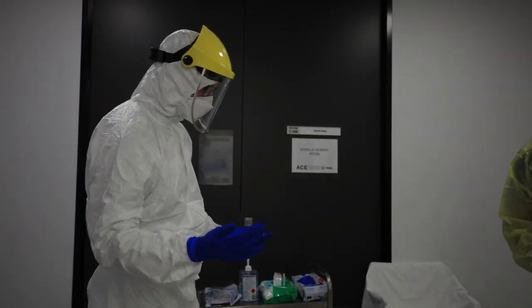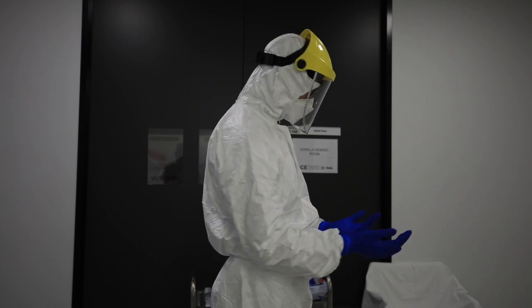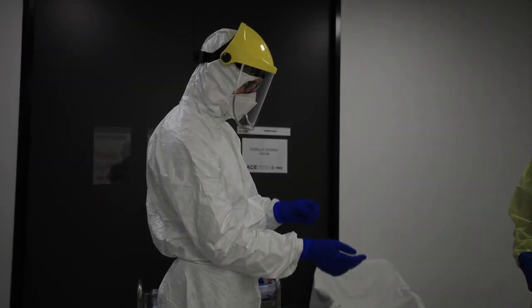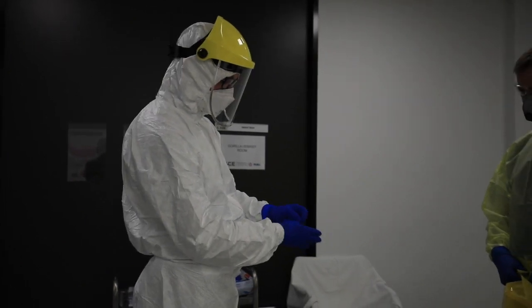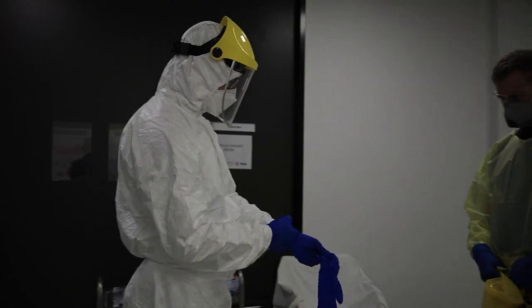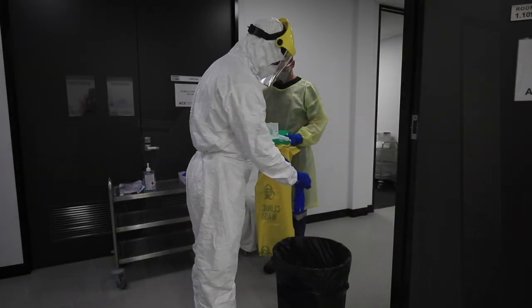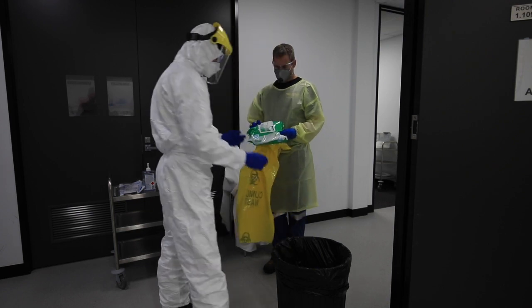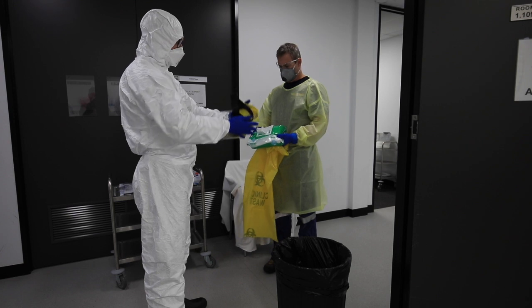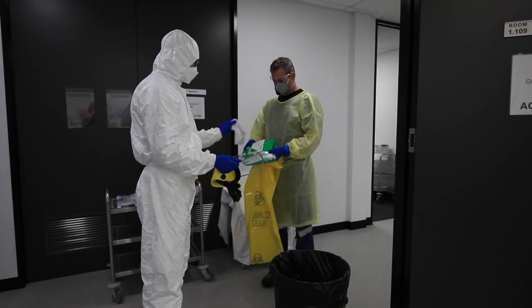Coming from the red zone contaminated, now I'm in the anti-room and I'm going to doff my PPE using the stated approach. Taking outer gloves off only. Now I'm going to remove the visor and give it a preliminary wipe with our disinfectant wipes.